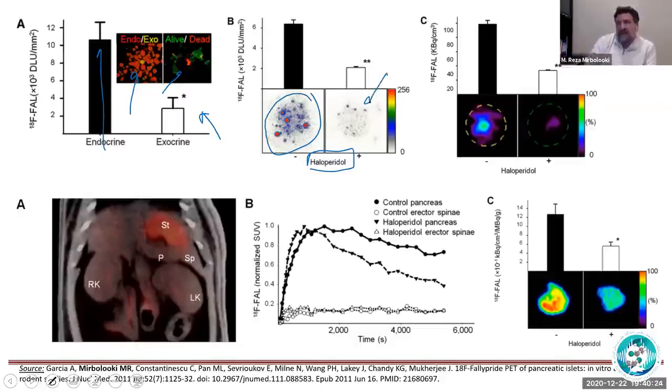We also wanted to see if a PET scan can detect this very low number, about 50 islet equivalents of the cells here, and pick up the signal. So we put this slide under the PET scan, and we saw that there is a difference between the two. So the PET can determine the difference at even as low as 50 islet equivalents.